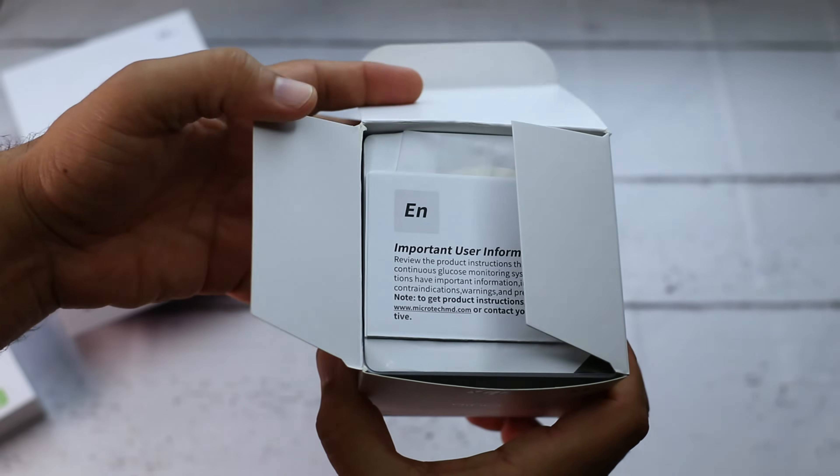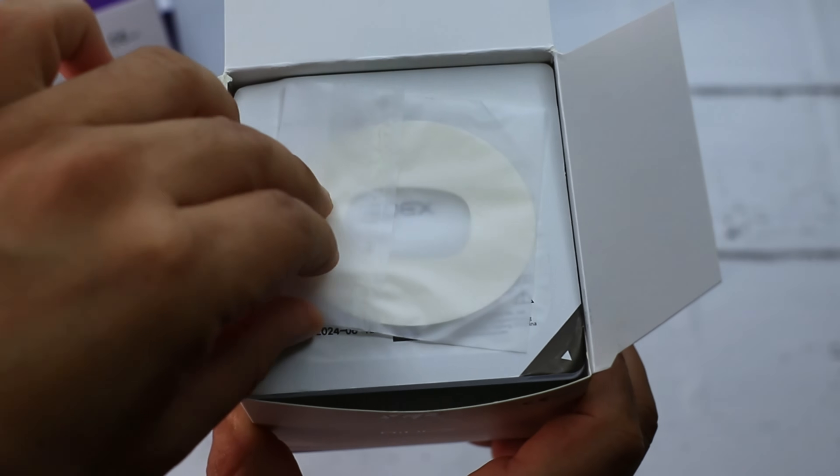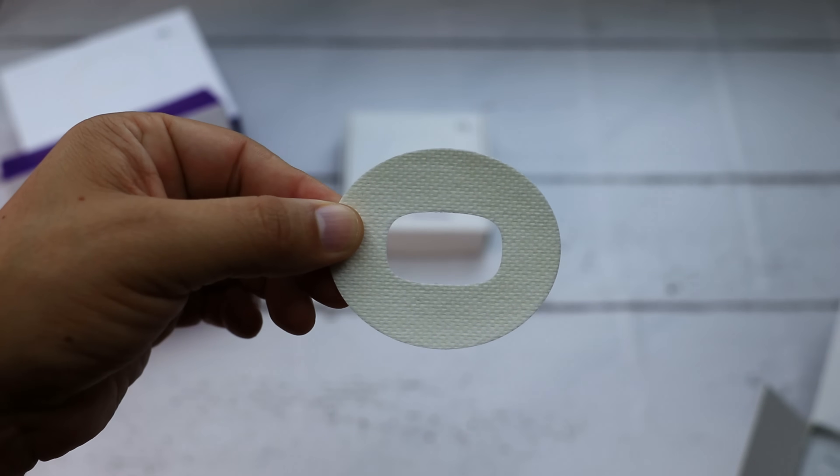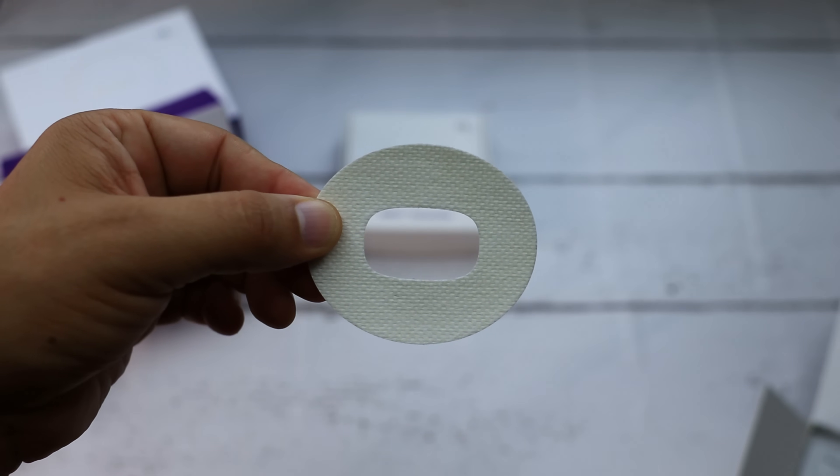Inside the sensor package, you will find an additional adhesive pad. This sticker is used to provide extra security to ensure that the sensor stays in place.